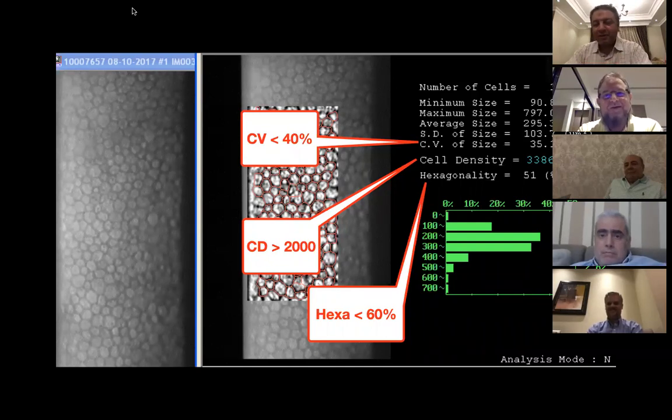Actually, I asked the question, which I don't have the answer for, but logically, we will put a rule. If I find that my patient is losing more endothelium than expected within the first 2 or 3 years, depending upon the original cell density and hexagonality, and they are progressing badly, I will remove the phakic IOL before losing the cornea.